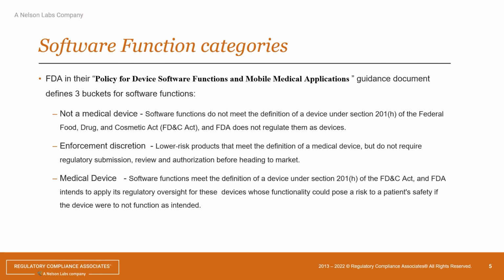And these could be things that are used in the healthcare environment, but really they don't have any impact on care, for example your accounting system or your appointment systems. And FDA, by the way, in this guidance document does have 3 separate appendices that cover examples of each of these categories.